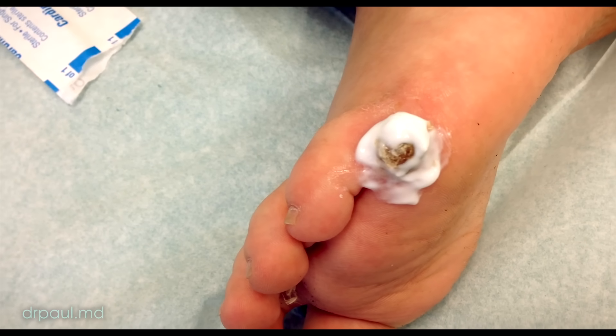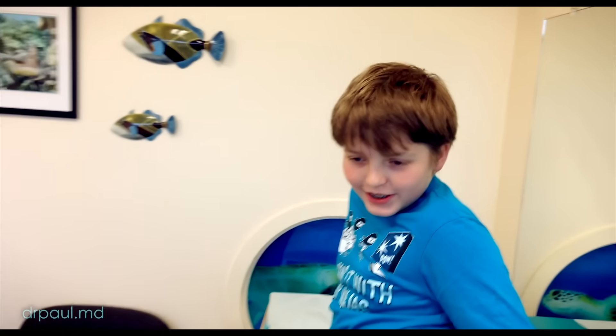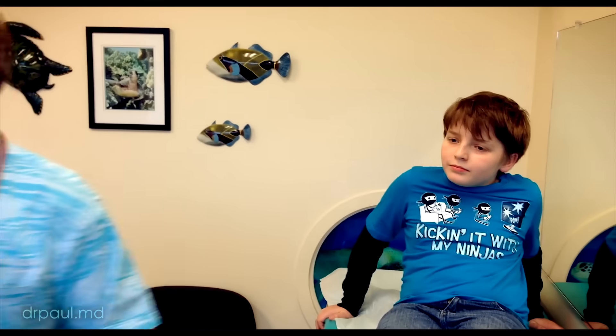Well, 'off' isn't quite the right word — we're going to freeze it, and then it will just sort of melt away over the next three to four weeks. Alright, we'll be back in 15 to 20 minutes.